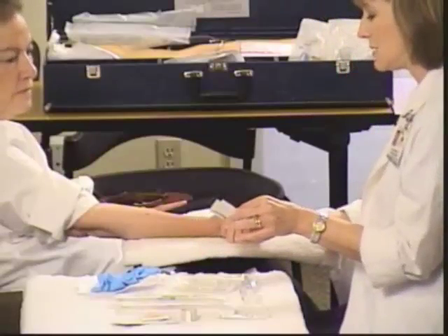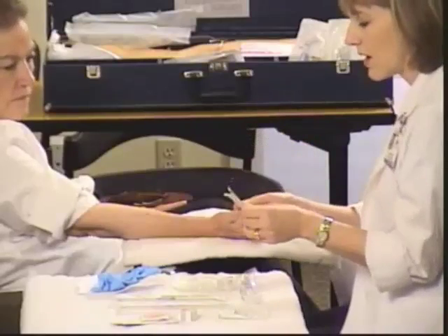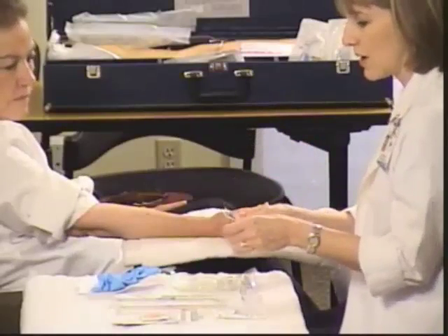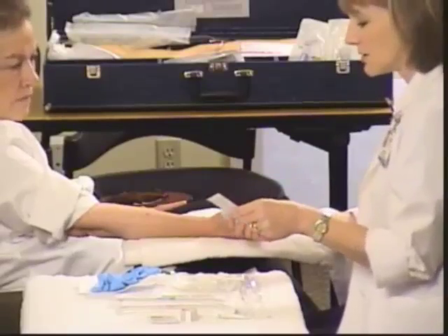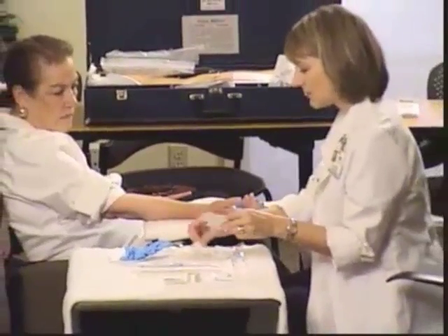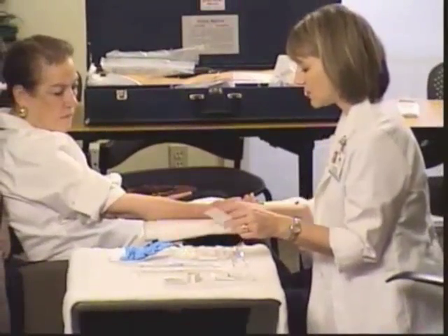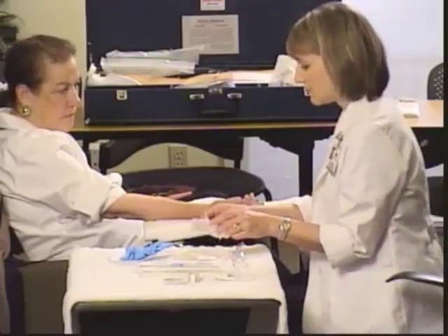If your policy is to use betadine, you've got betadine right here; if it's to use alcohol, you have alcohol. Always bring extra alcohol so you can do the horizontal, vertical, and circular cleaning. We also have gauze if we need it, and we've got our transparent dressing and tape. We're not going to set up the tape just yet — we're going to wait on that.